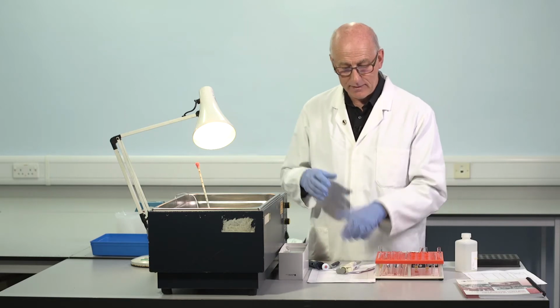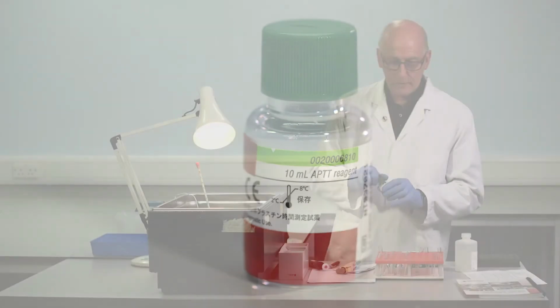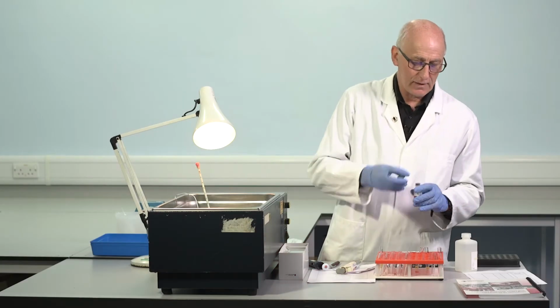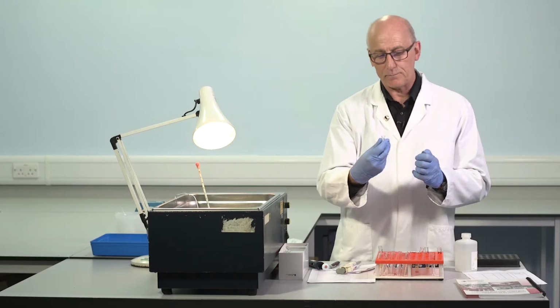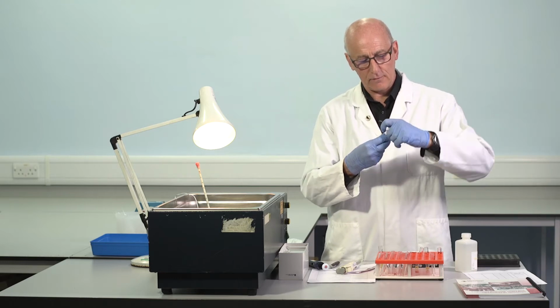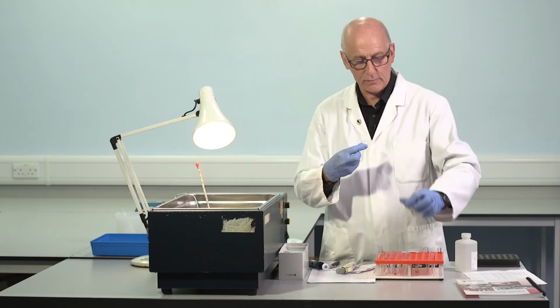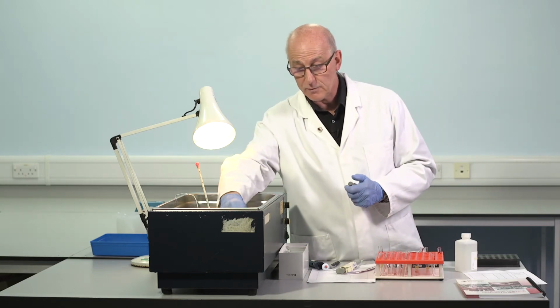So whilst that's just warming, in a moment we'll be adding APTT reagent. The APTT reagent that's used can be the same as used for routine testing. We need to place a volume of this, sufficient for this assay, into the water bath so it's coming up to temperature just whilst we're talking.